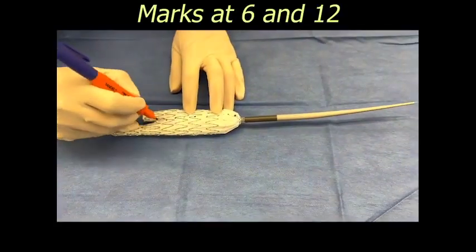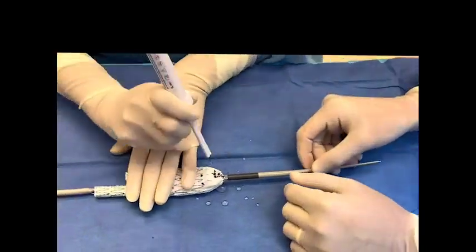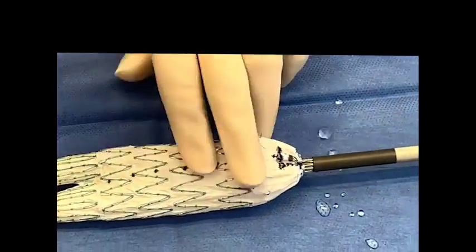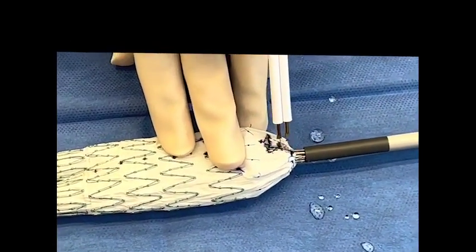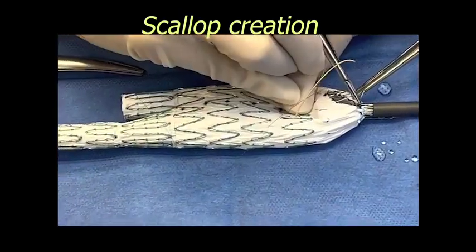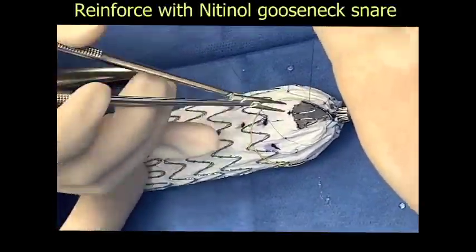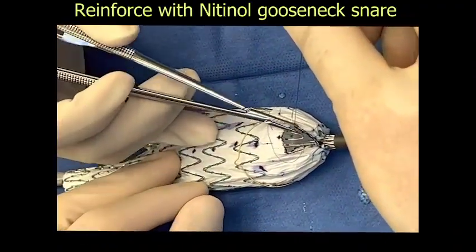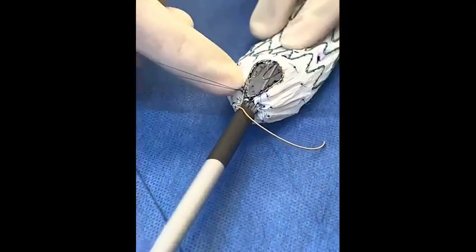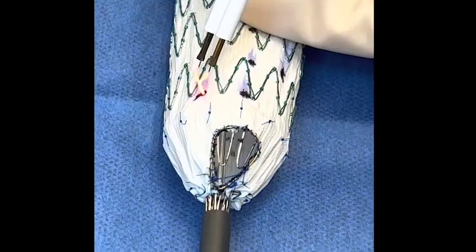We first marked the orientation at 6 o'clock and 12 o'clock position. Prior to surgery, we used 3D reconstruction as well as TeraRecon imaging system to plan our case. Fenestrations and scallops are created using handheld cautery, and then we reinforced both fenestration and the scallop with the nitinol and gold gooseneck snare. The scallop is created in a triangular shape as the proximal portion of the graft is constrained, and it will widen out to a more U shape once the proximal suprarenal stents are released.